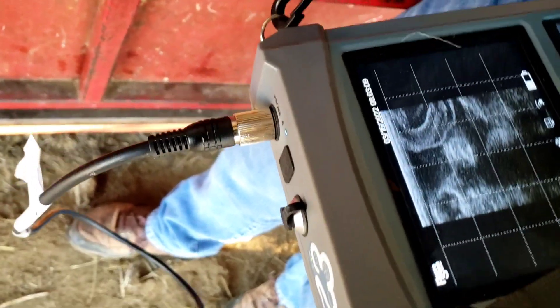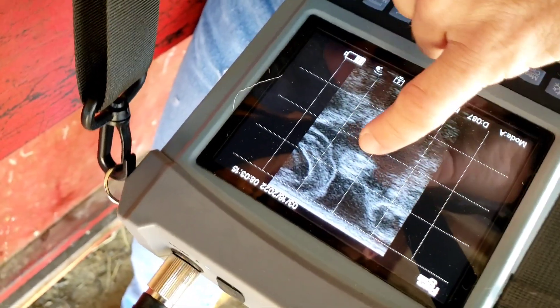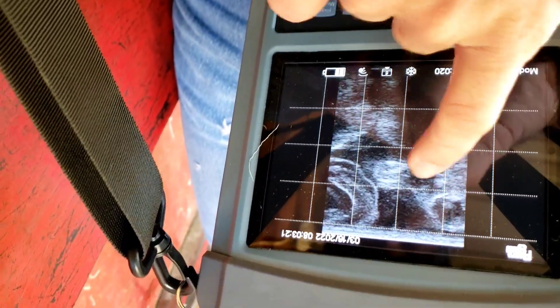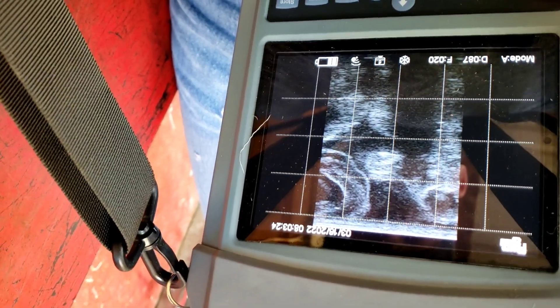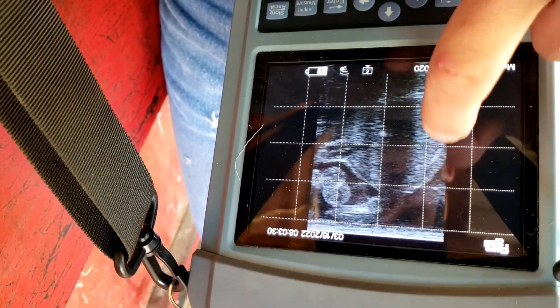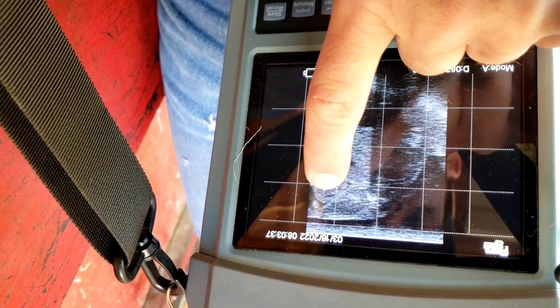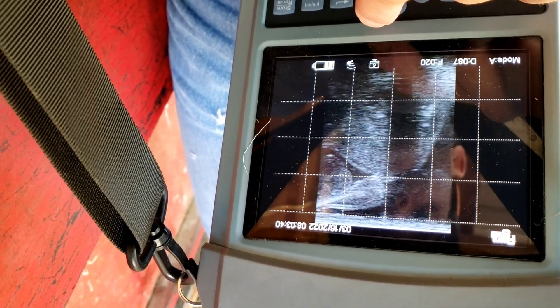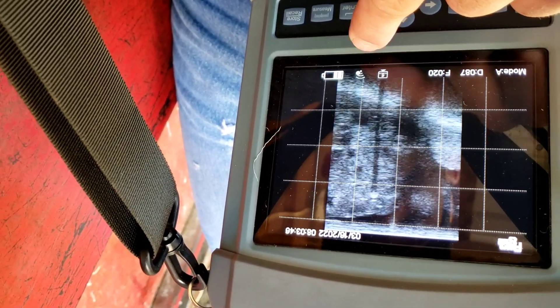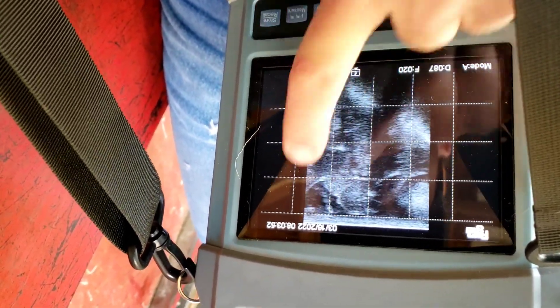We got an eyeball here. Looking at the head - to me it looks more like a little bird beak. The eye's hollow, we got some fluid in it obviously because it's an eye. I'm gonna unfreeze it and see. So this is chest, abdomen, and - hey, that's a boy! See those two testicles? I'm pretty sure that's what that is. We got two legs here, something right in between - a leg there and a leg there.